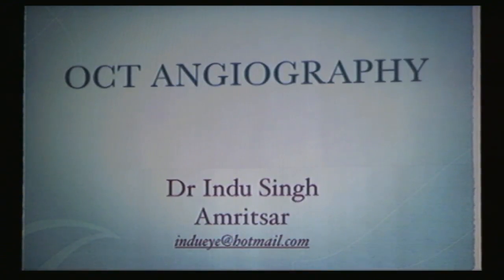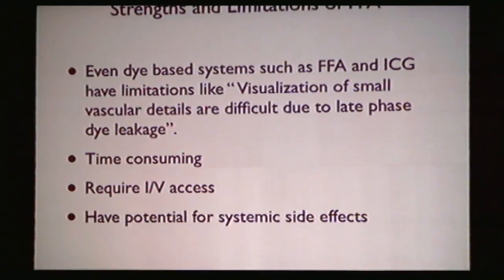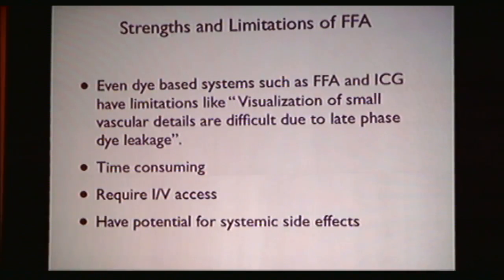After 2 months in the same patient, another finding you notice here is hyperreflective dots. It means the hyperreflective dots have come down and the SRF has come down. So that's another marker for us to note in case of chronic CSR.